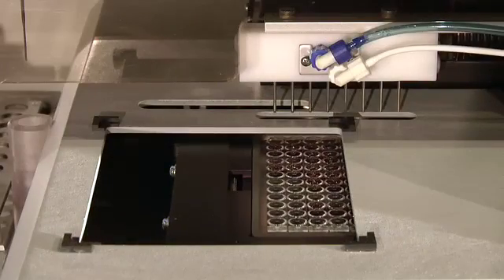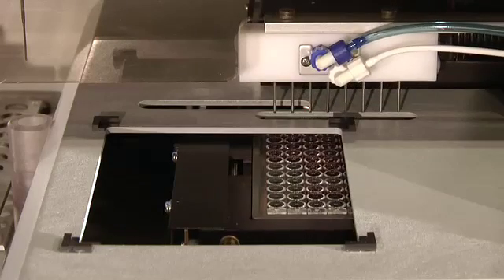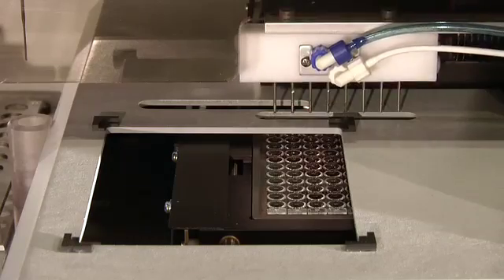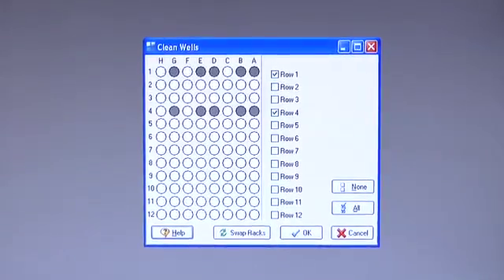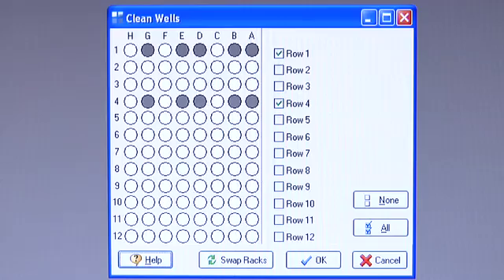Located behind the reaction plate is a wash station that quickly and effectively cleans the cuvettes. The operator can program the system to automatically wash the reaction wells after each test or select this function manually from a software menu. The cuvettes can either be reused or disposed of after testing, providing maximum flexibility and cost savings.